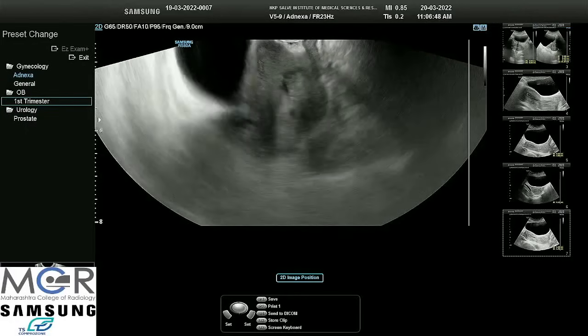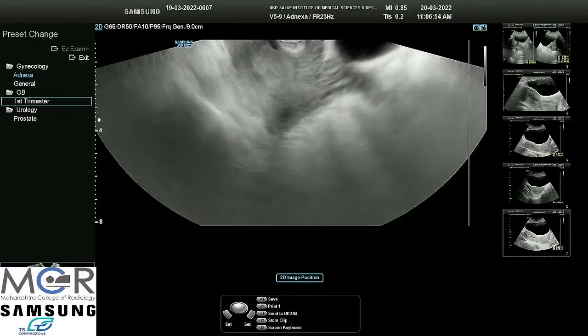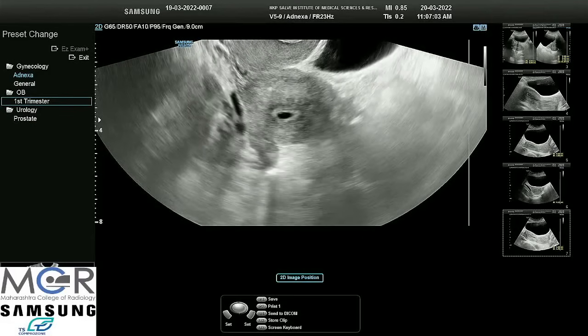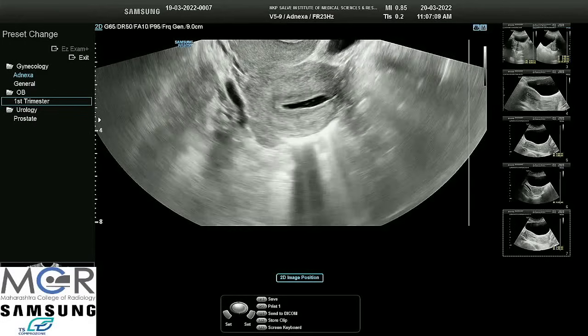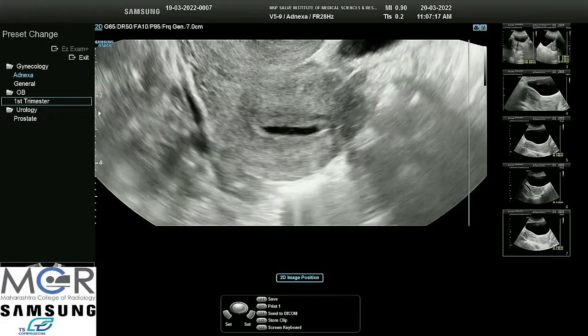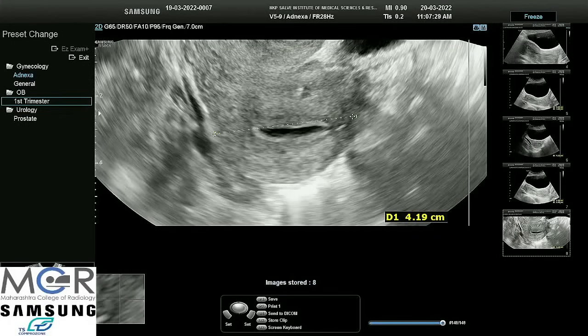We had seen the uterus in long axis, and at this end we turn our hand by 90 degrees so that we can get a coronal view. Sometimes we need to use our left hand on the abdomen to get a clear picture — we press from above. We magnify a little and increase the depth so we can take a transverse measurement. Her uterus size is normal.